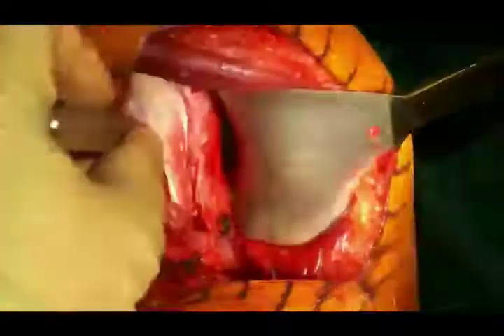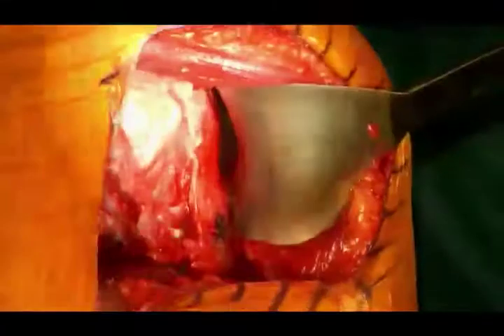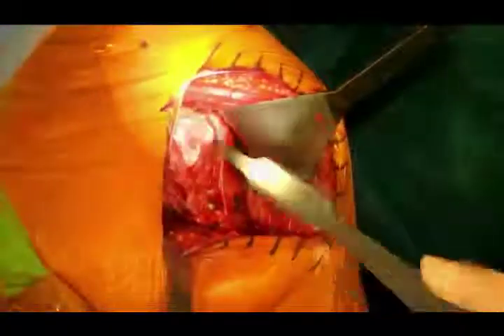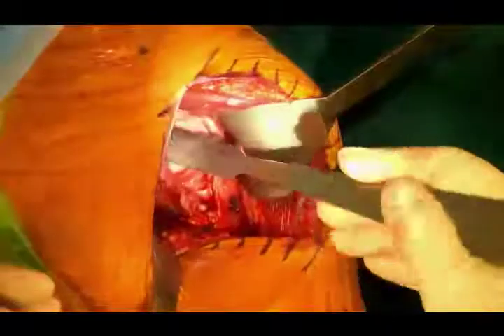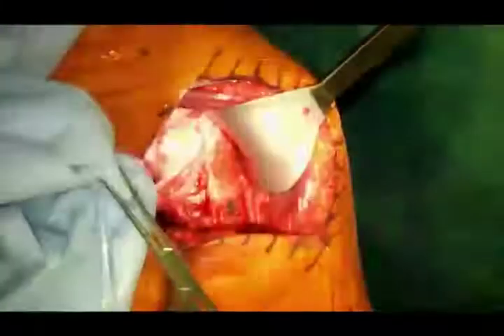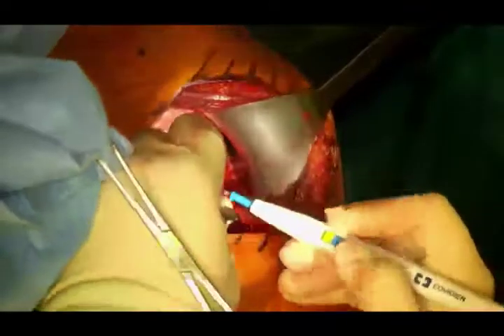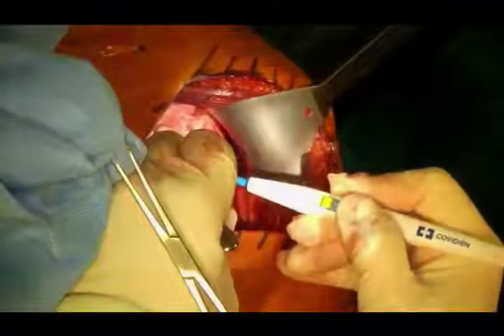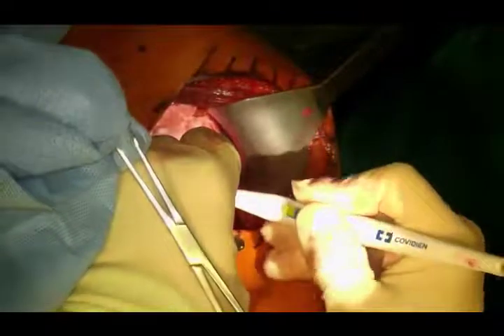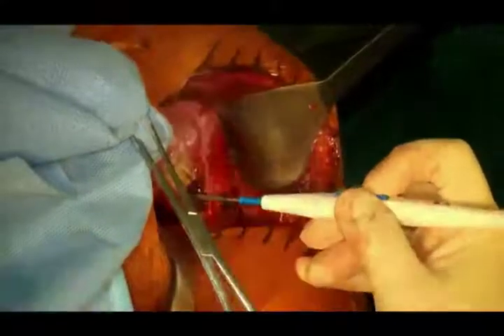If you only release 10 to 20 percent, that's not really going to get you any more motion — you need to release probably 40 percent. I've now gotten rid of the rest of the biceps tendon. I'm ready to start releasing what's left of his subscapularis, which isn't much. I place a large sharp homen around the humeral neck and hinge it anteriorly to create tension on the subscapularis. His lesser tuberosity is way up here — almost down to the humeral ligament. I will repair whatever's remaining of the subscapularis at the end of the case.